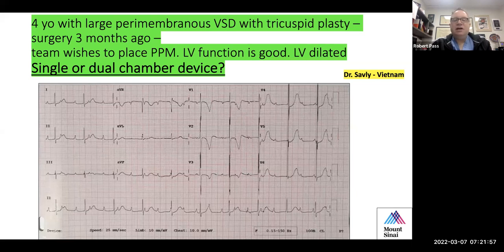It was very uncommon that patients didn't do well with just a single chamber device. And pacemakers at that time didn't even have the fast heart rates that they have today. So you would sometimes send a baby home with a heart rate of 80, which of course today we would say is too slow. But patients did fine like that. Maybe it wasn't optimal, but they did fine.